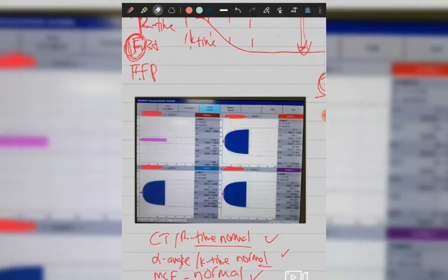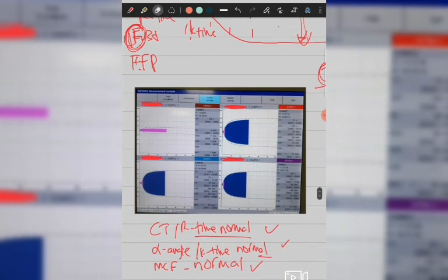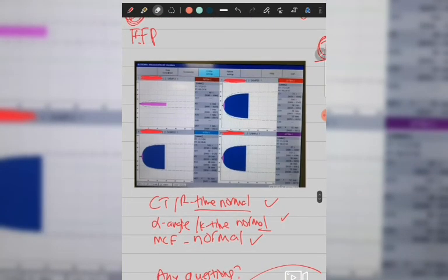Today, just to continue with the example that we have here, our patient's ROTEM. Basically, it's more of a pattern recognition. If you've seen a lot, then you'll know certain patterns reflect what the problem is. We just go with the normal ROTEM first.